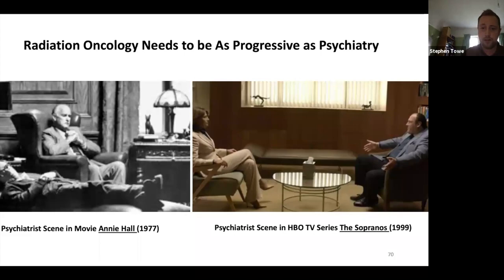The second question is from Dr. Wilkinson, who's asked, is there an advantage from an anatomy perspective to treating in the upright position? Well, certainly. Again, I went through some of the advantages from the head and neck: being able to swallow better, gastric reflux avoidance, and the lung moves less normal tissue in the field. The liver is slowly moving as you change posture, so if you don't have to change posture, the liver is going to be moving less for the radiotherapy. There's also less movement because the diaphragm is moving less. Again, the lung is better ventilated. So I think all of the abdominal and thoracic sites could be better treated in the upright position.